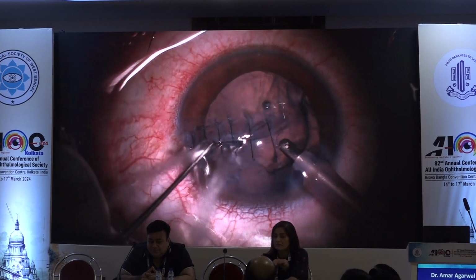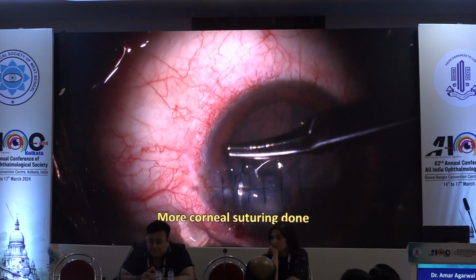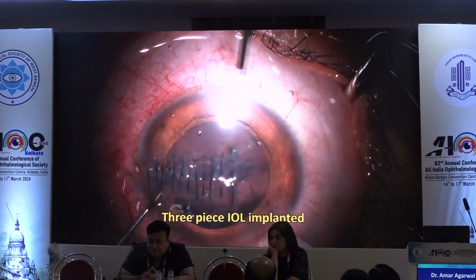Still leaking like crazy. I have an upper burner this time. Okay, my heart is sinking even more, by the way. I'm trying to avoid PK. You see how dumb I am, thinking of the craziest things.